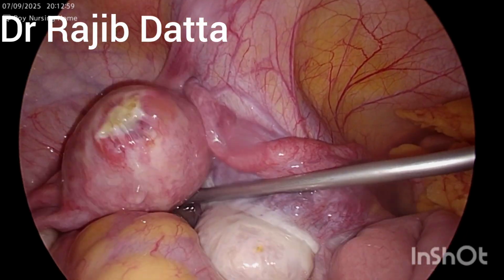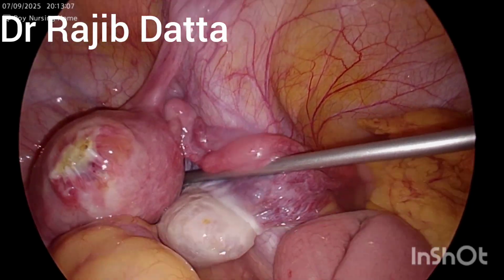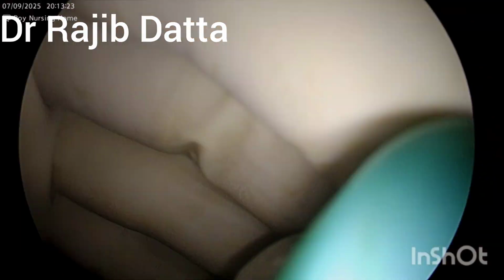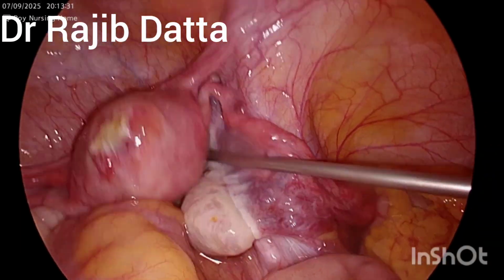So the pouch of Douglas is thoroughly washed out, the anterior aspect of the uterus is properly washed. The white balance has somehow changed, so it is again reintroduced and white balance done.